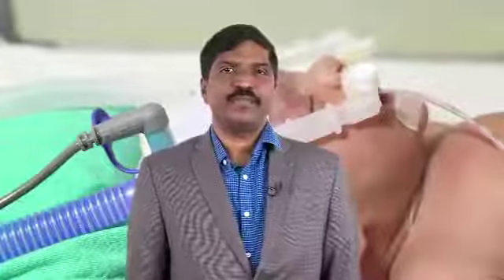This figure shows the components of an ideal bubble CPAP setup: air and oxygen, blender, flow meter, servo humidifier, inspiratory limb, nasal interface, expiratory limb and bubble chamber.